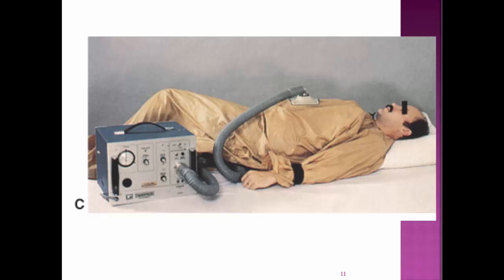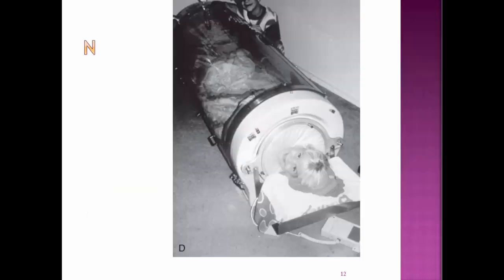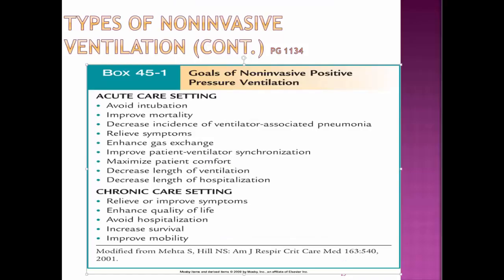Again, you got to have that rigidness so that it doesn't collapse the bodysuit itself, but it causes the chest to rise. And here's a version of the portalung. You can see how it might be a little bit more portable than the original iron lung. So you could actually maybe travel or go places with this.